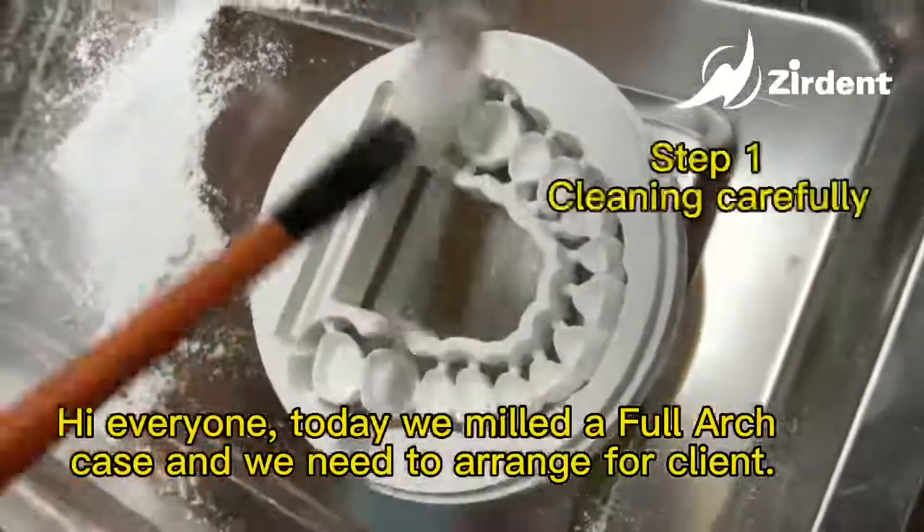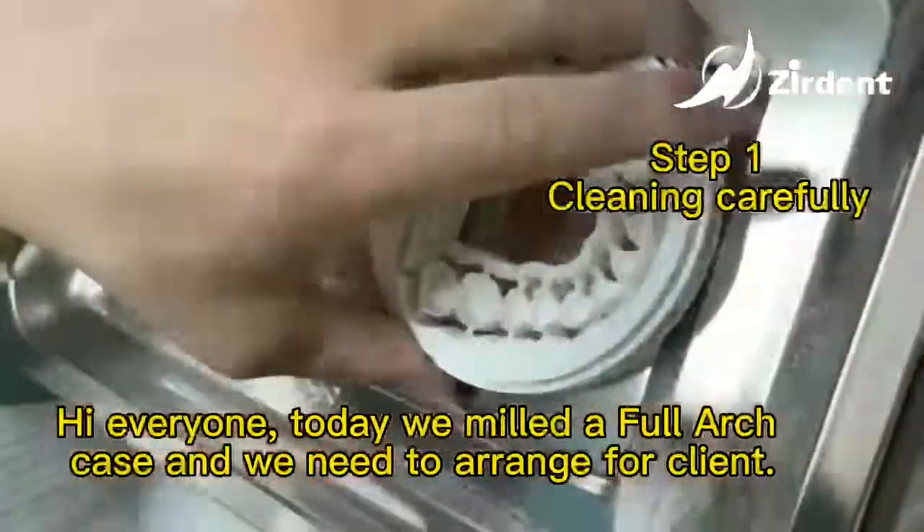Hi everyone, today we mill the full arch case, and we need to rearrange for the client.